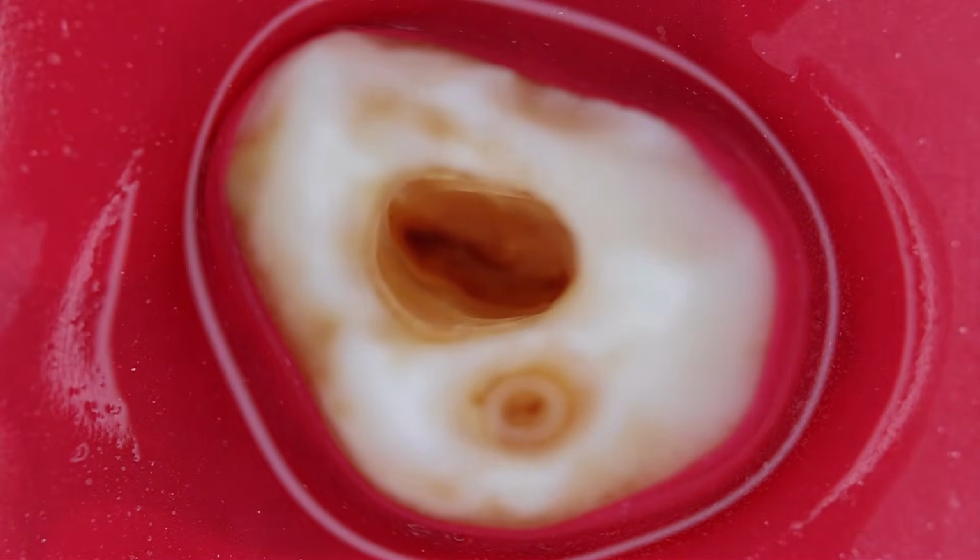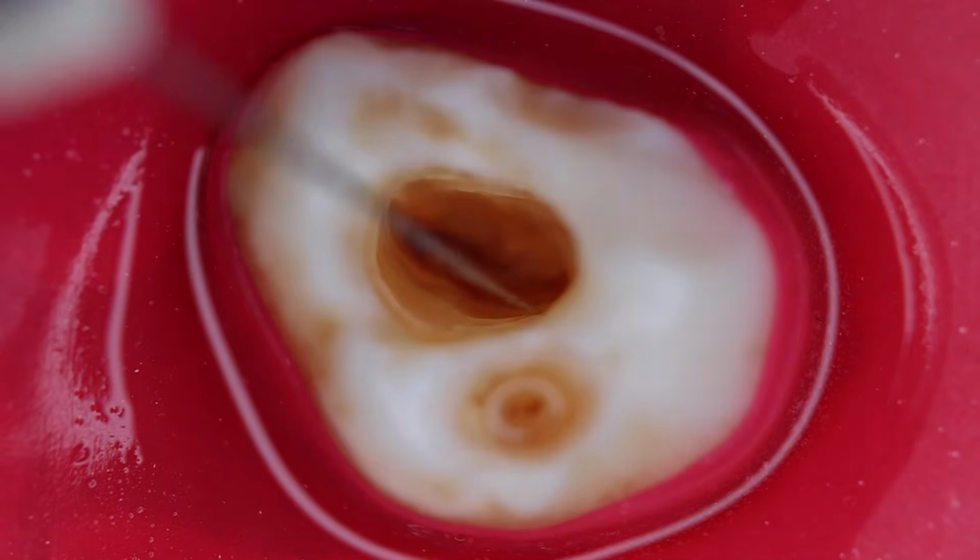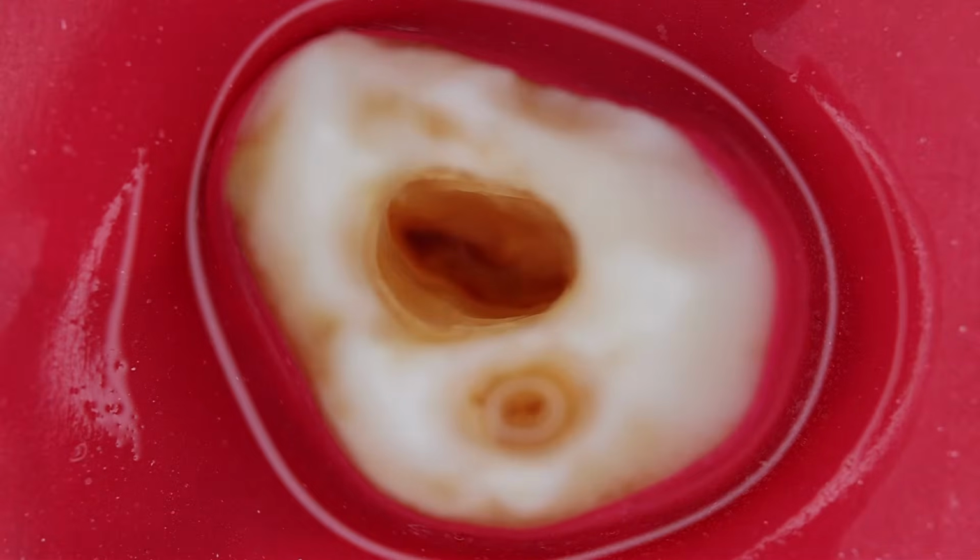So this again comes out at roughly 18 millimeters. Then take the working length of the palatal canal, the large palatal canal. Now it is going beyond 19 mm roughly. So your working length is 18, reduce 0.5 to 1 millimeter. That would bring you to the biological apex, not the radiographic apex.